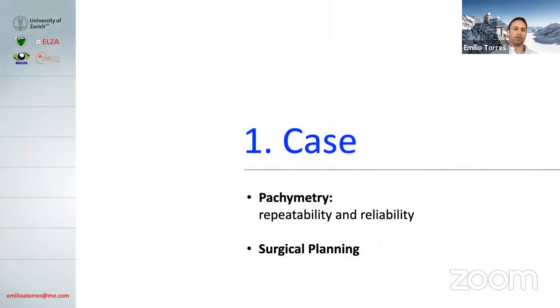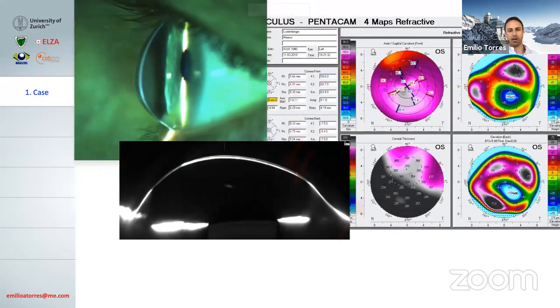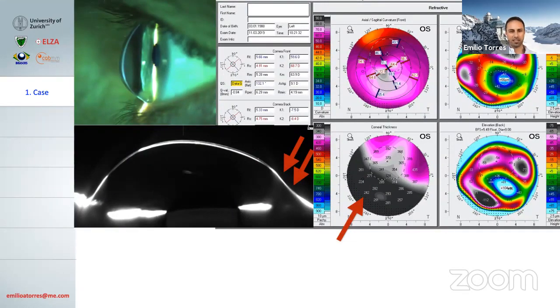From now on, I will show some cases in which we used OCT and it was decisive. So instead of speaking, I will show you some cases we had. This first case was a patient with keratoglobus. He had a very intense protrusion, as you can see here. There is not only a diffuse thinning, but also some opacities. And when we see the Scheimpflug images, on the left inferior side, we can see how those opacities limit the ability to view the endothelial level or more posterior in the cornea.